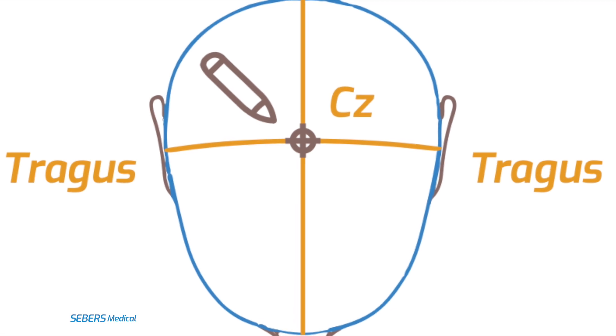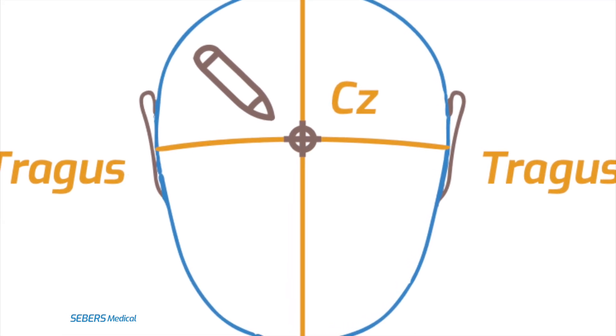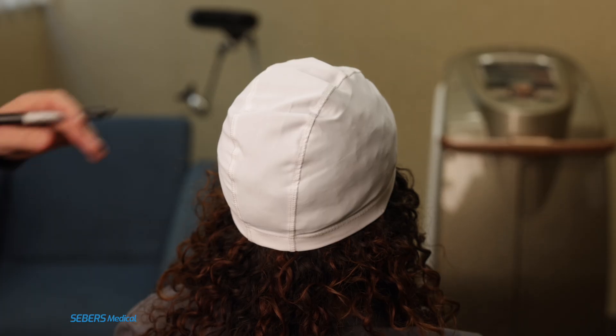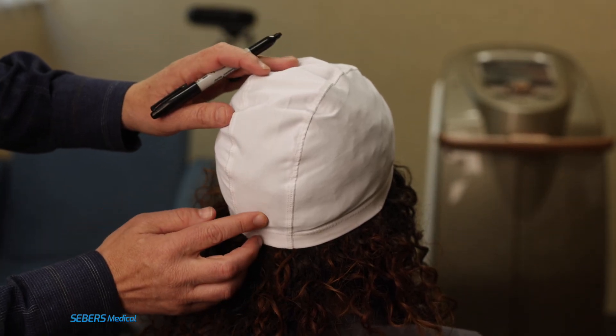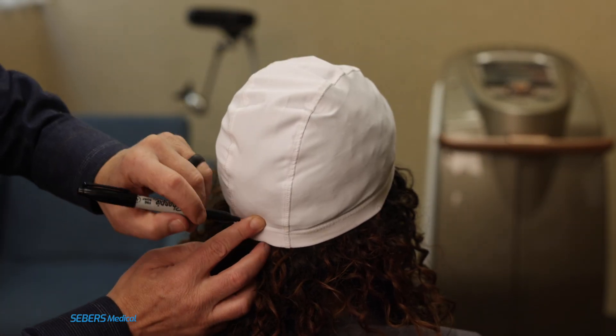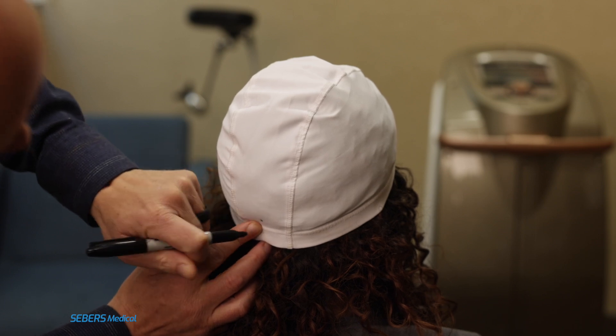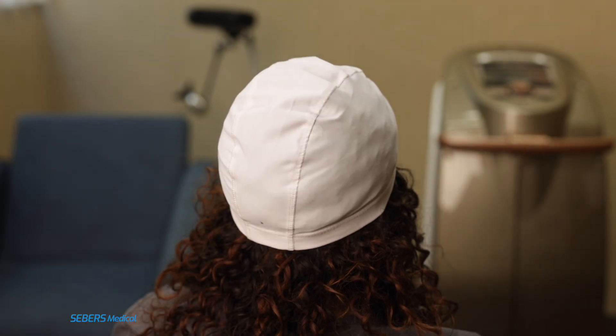Next we need to find CZ, or central zero, the anatomical center point of the scalp. To begin, locate the inion — the bony bump at the lower back of the skull. Use your fingers to gently feel along the midline at the base of the skull until you find the most prominent point. This is the inion.